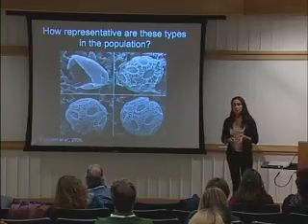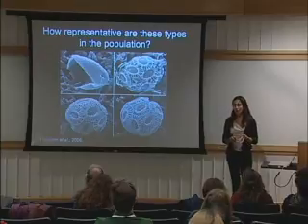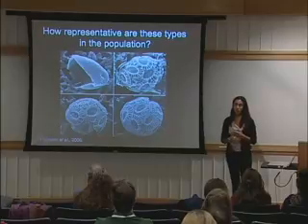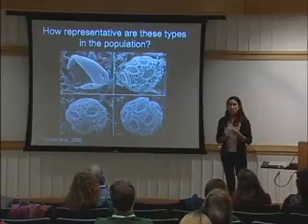There are media that have 3 times more bicarbonate than natural seawater. There is a media recipe that many people are using that has the wrong magnesium to calcium ratios, and not only the ratios, but the calcium levels are very low, so the cells sometimes show malformations of coccoliths. So it's very important to pay attention to the media recipes.